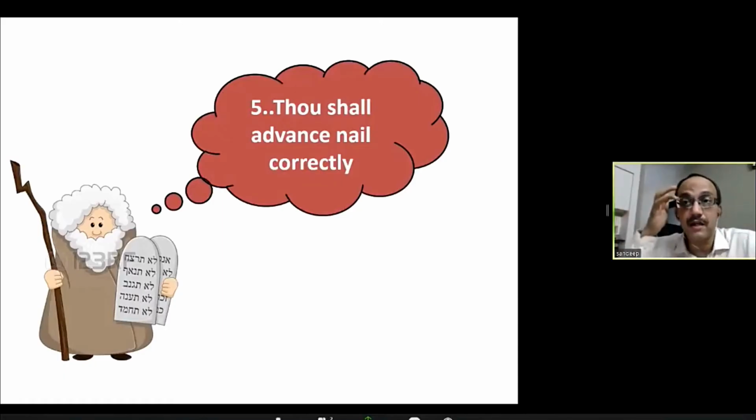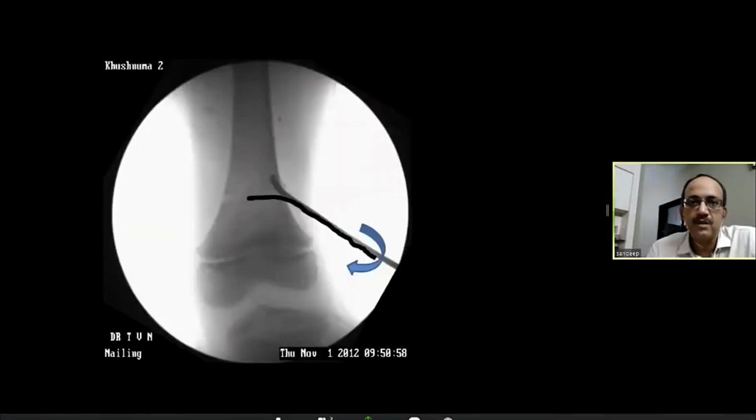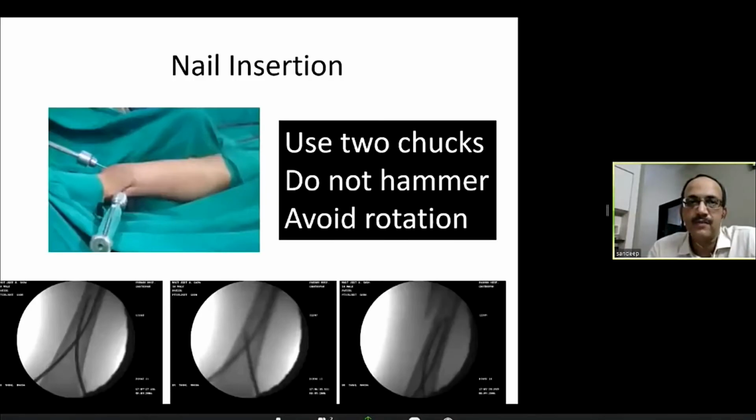The 5th commandment that I wanted to speak about was how do you advance the nail in the canal. So the commandment 5 is thou shall advance the nail correctly. So when you enter the entry point where you have made the adequate entry point, your nail should go in the direction of the curve, right? So this is how you enter, rather than struggling by trying to push it in directly. Go with the curve into the canal first, then turn it around 180 degrees to face the medullary canal.